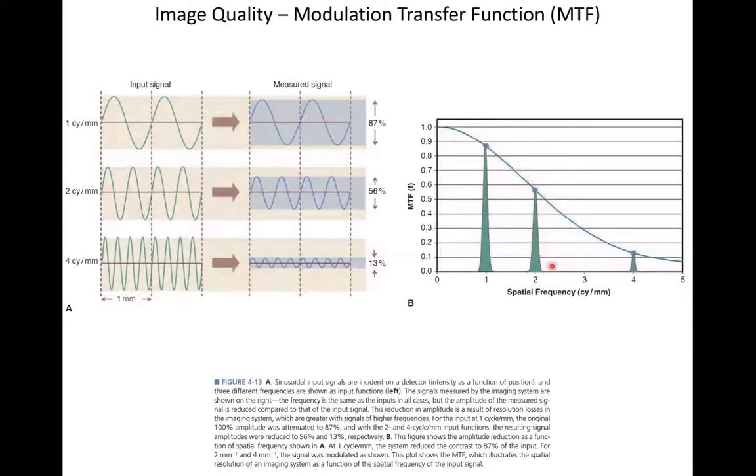We go down here and say, well, that's 2.2 cycles per millimeter. That's a sensible proposition, but most manufacturers don't do that. When they give you this MTF, they will say, we can resolve things sometimes to 1%, 5%, 10% out here.